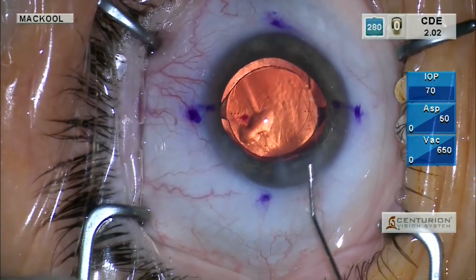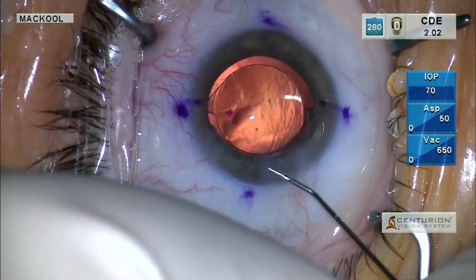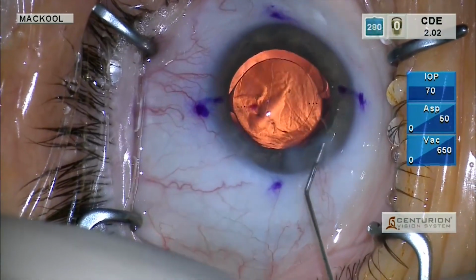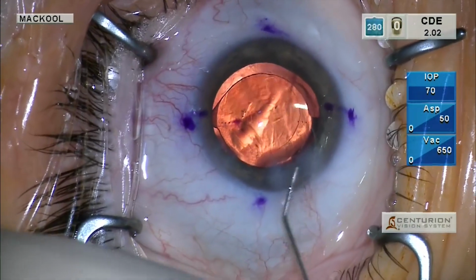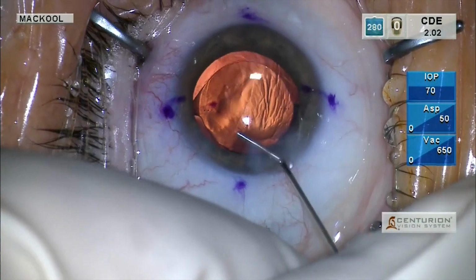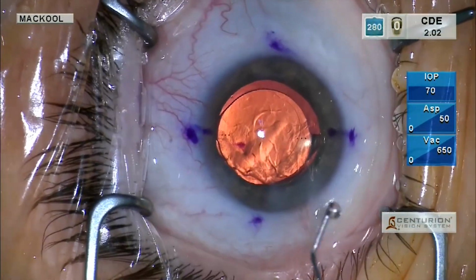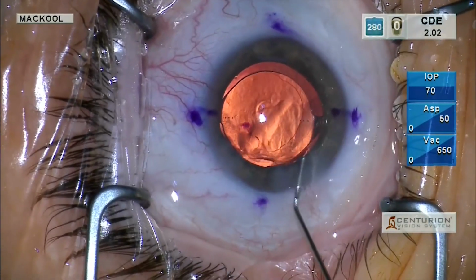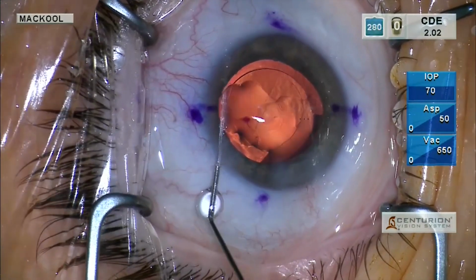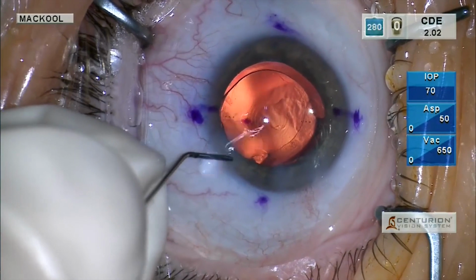So by going side to side, we deepen the chamber, hydrate each side of the primary incision. Think of the cornea as a sponge, and if you hydrate it, it swells. And if it swells, it seals the incision. And then go around the edges of the anterior chamber and irrigate the angle so you get the viscoelastic out that you just saw come out of the angle, and thereby really reduce your chances of a pressure spike. Do the same stromal hydration over here.